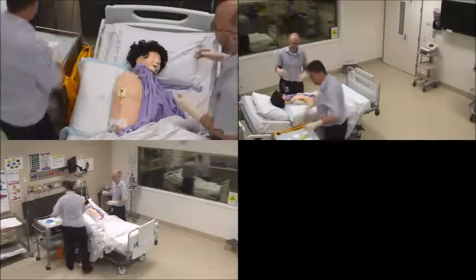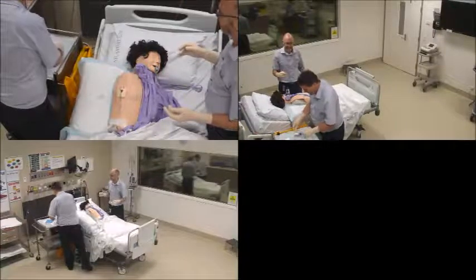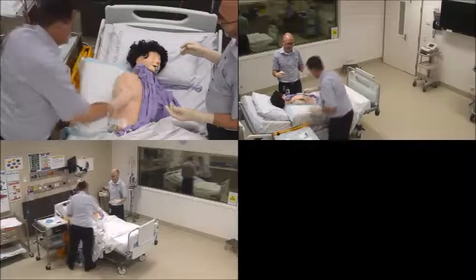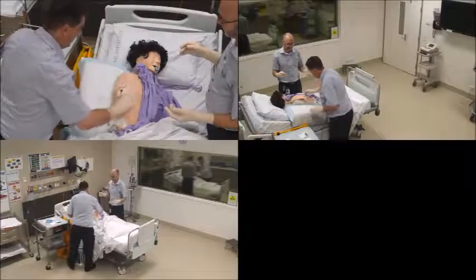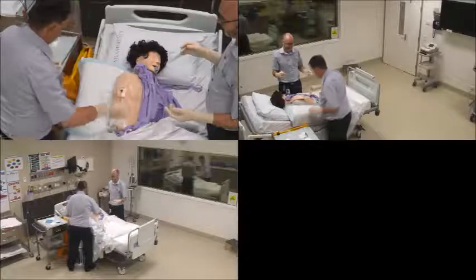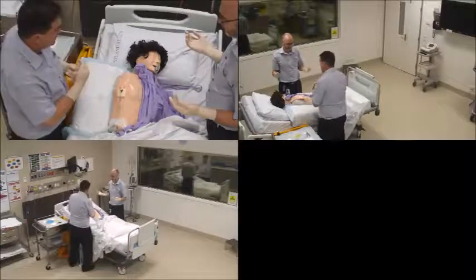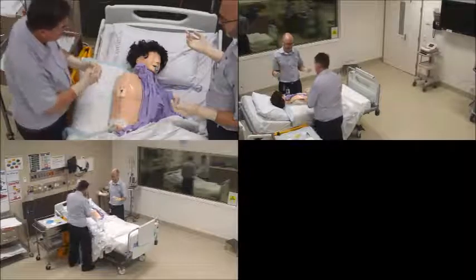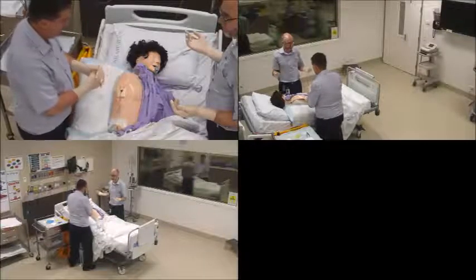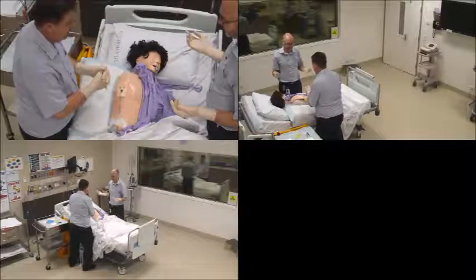Okay, Scott, are you happy if we continue? Yes. Okay, so I'm just going to clean around the site with some saline first up. It'll be a bit cold. Okay, and then we'll dry it off. Alrighty, Scott. We're going to practice that breathing technique that I was talking about before. Okay? Yeah. So first thing I want you to do, can you breathe in for me? And breathe out.